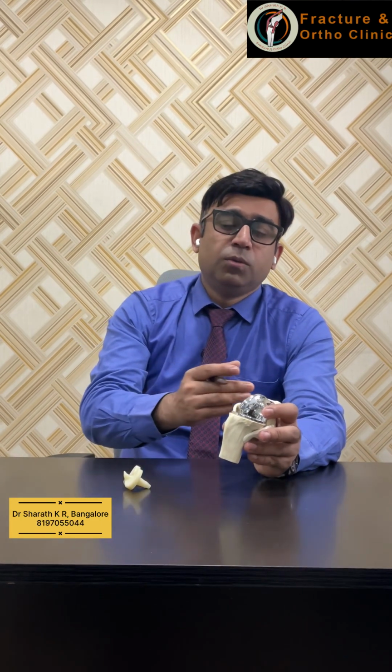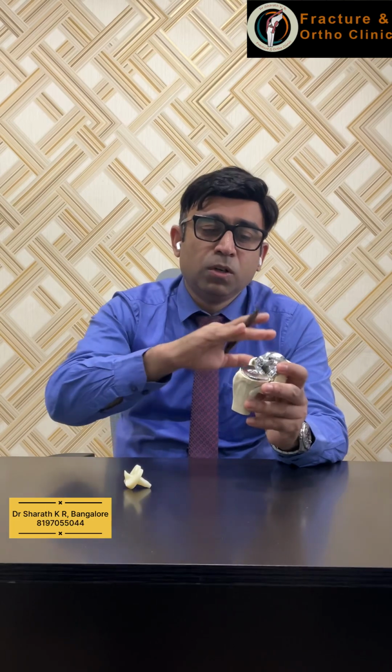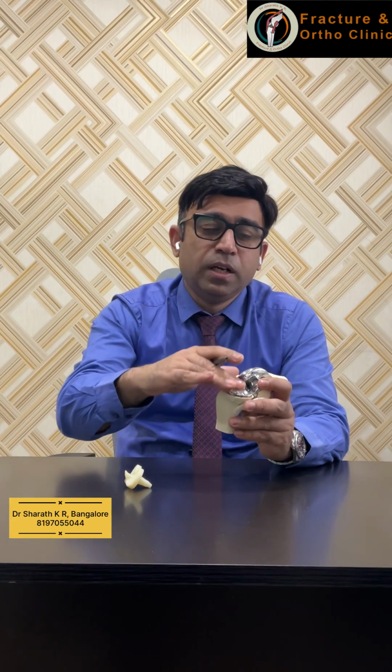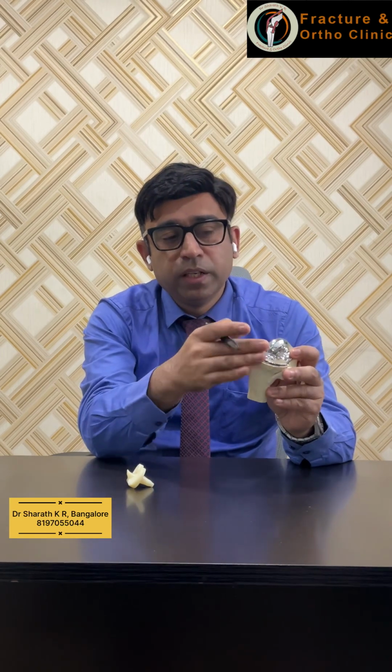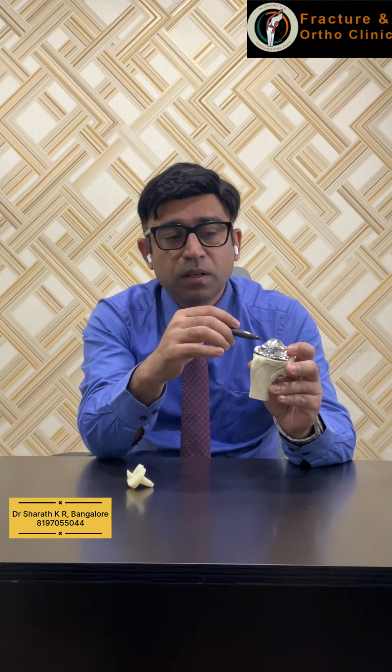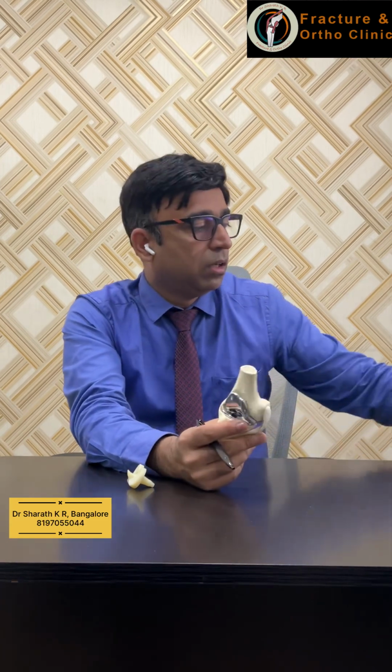That means whatever is the anatomy of the patient, we can change the resection in the coronal plane, sagittal plane, and in the three-dimensional plane. We can change the implant position up to 1 mm or up to 1 degree.